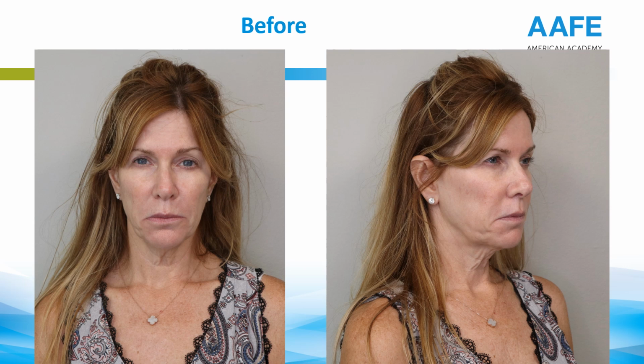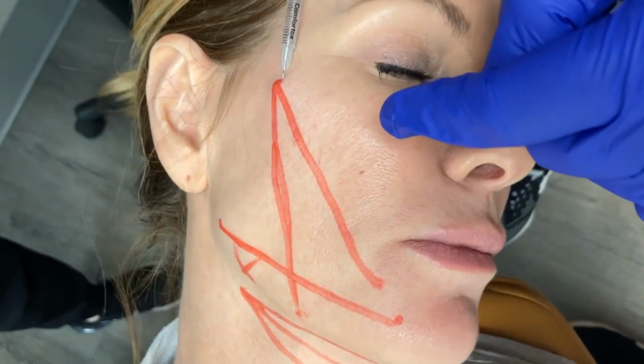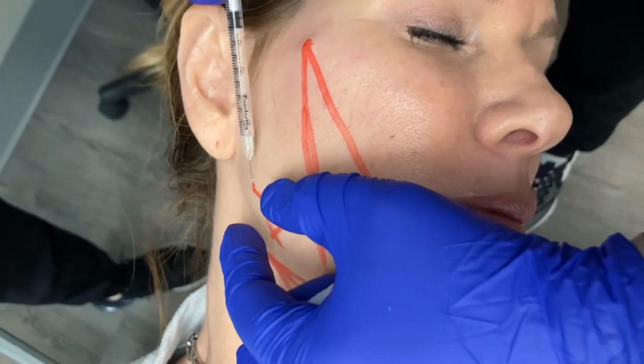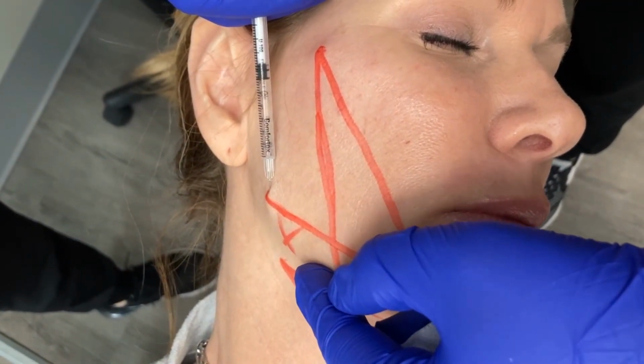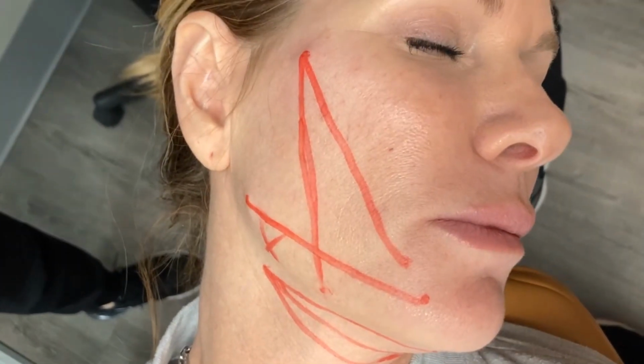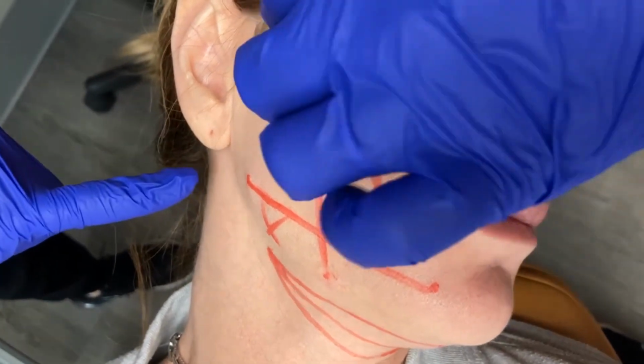So here we go. Let's go with this solid filler lifting PDO thread case. First, let's clean the patient off, map them, and give them a little bit of lidocaine 2% in a ComfortTox syringe right at the entry point where we are going to do this.